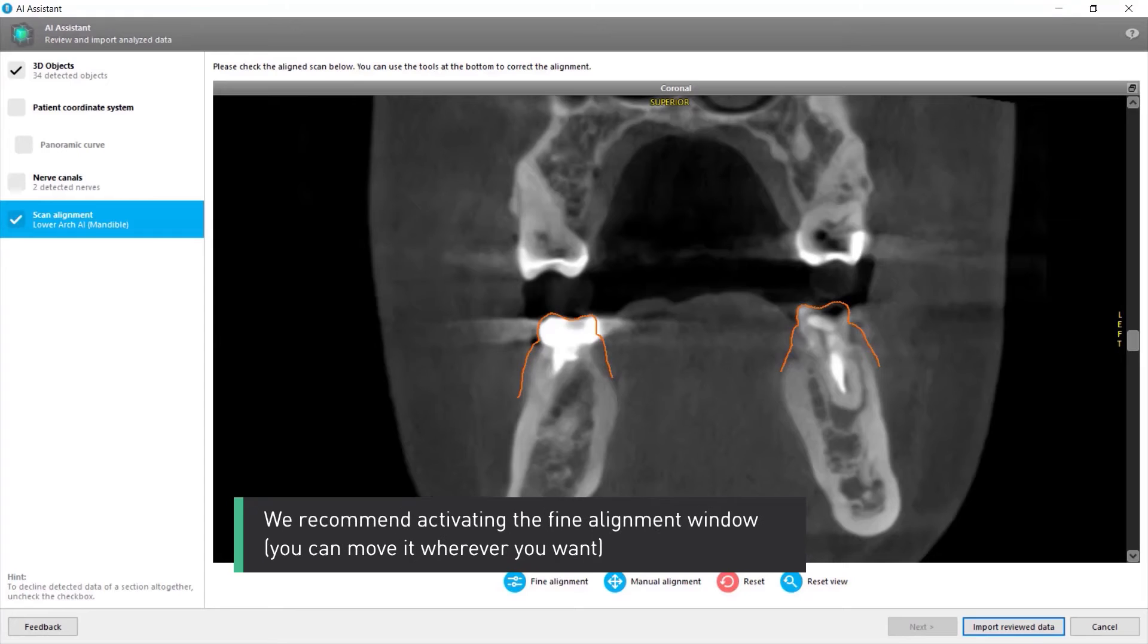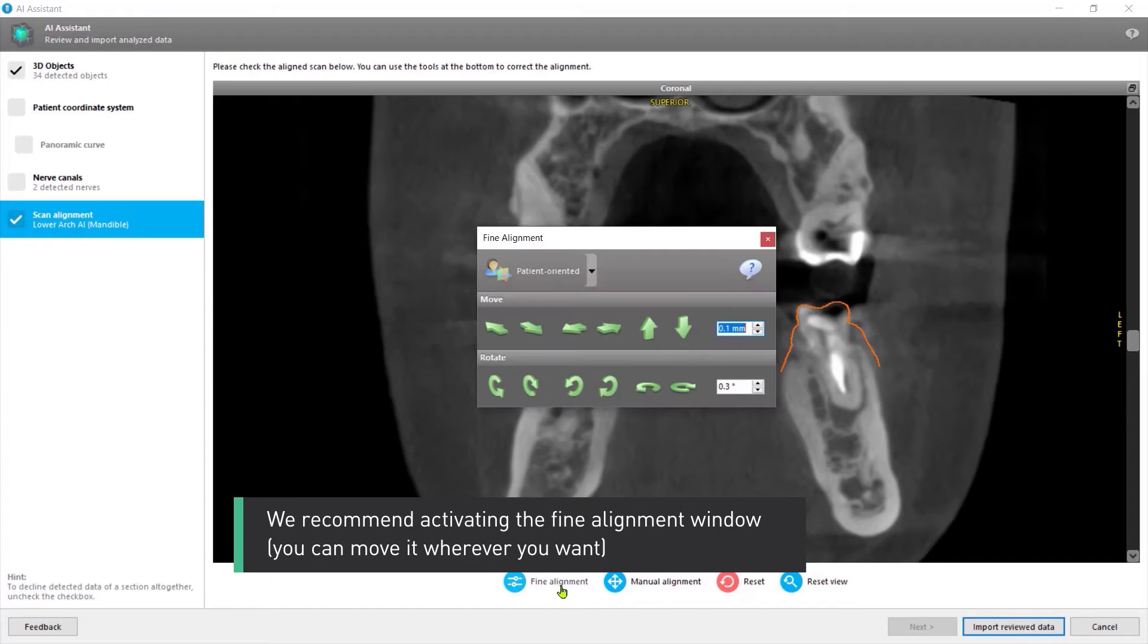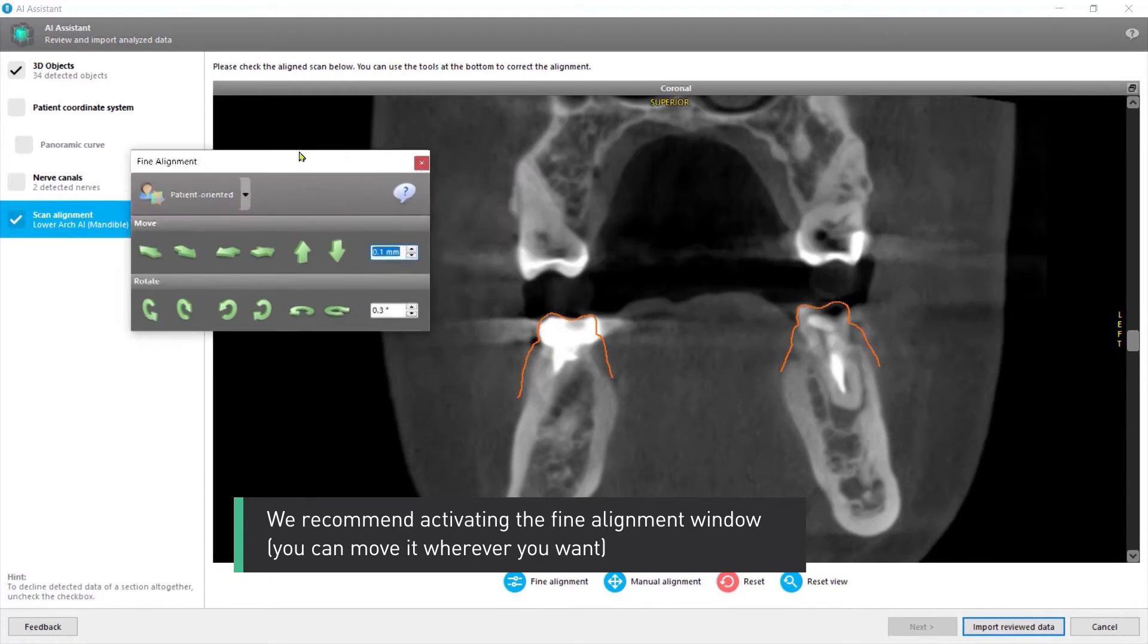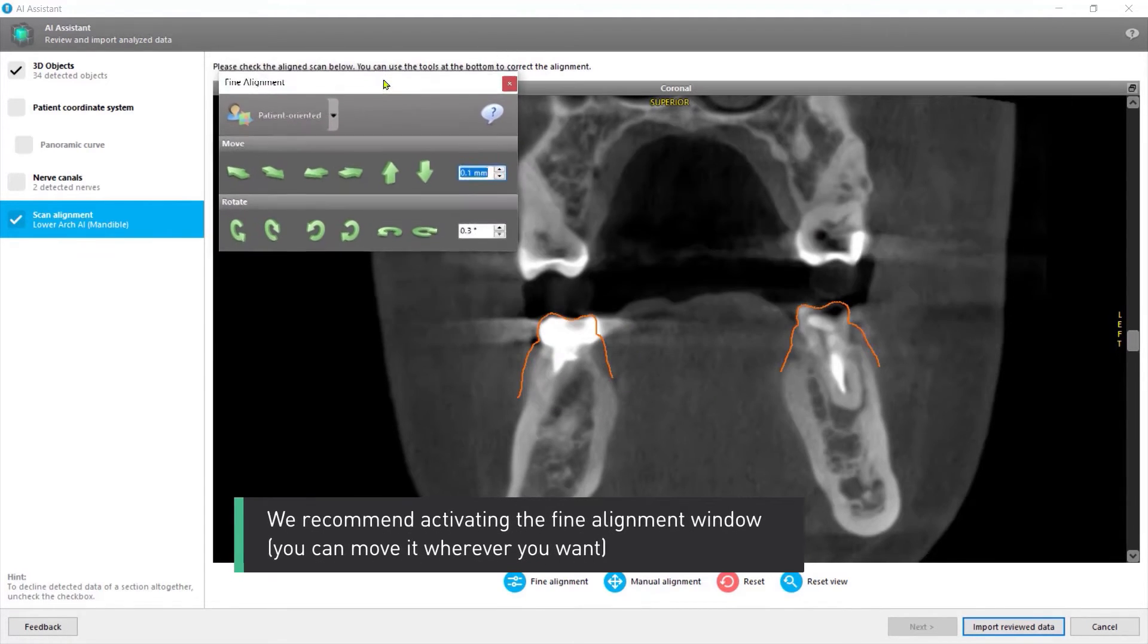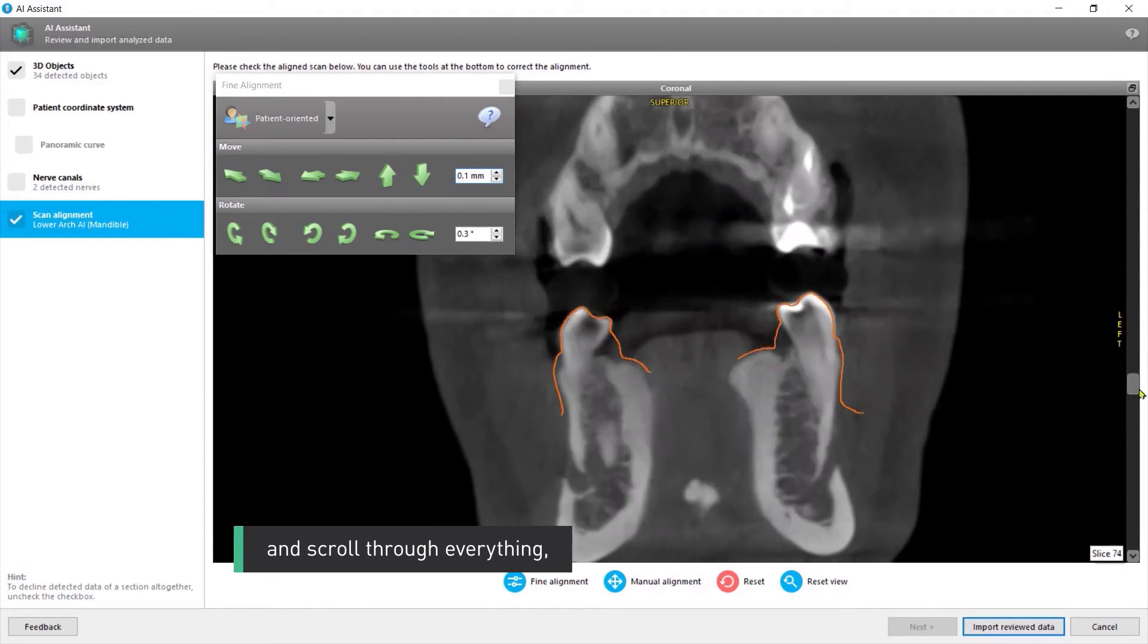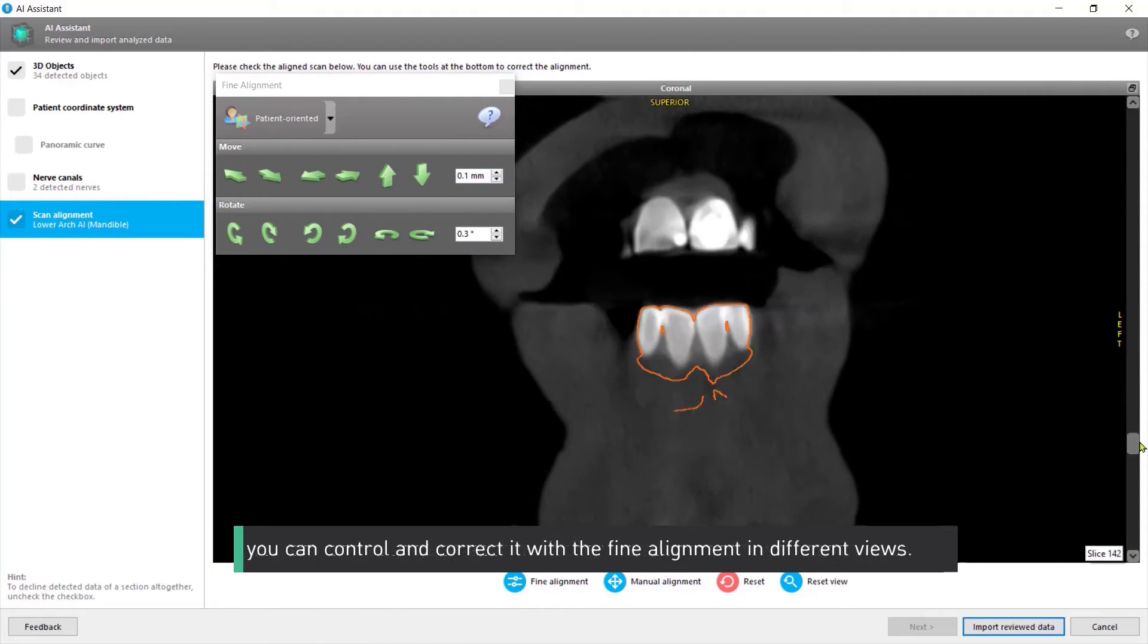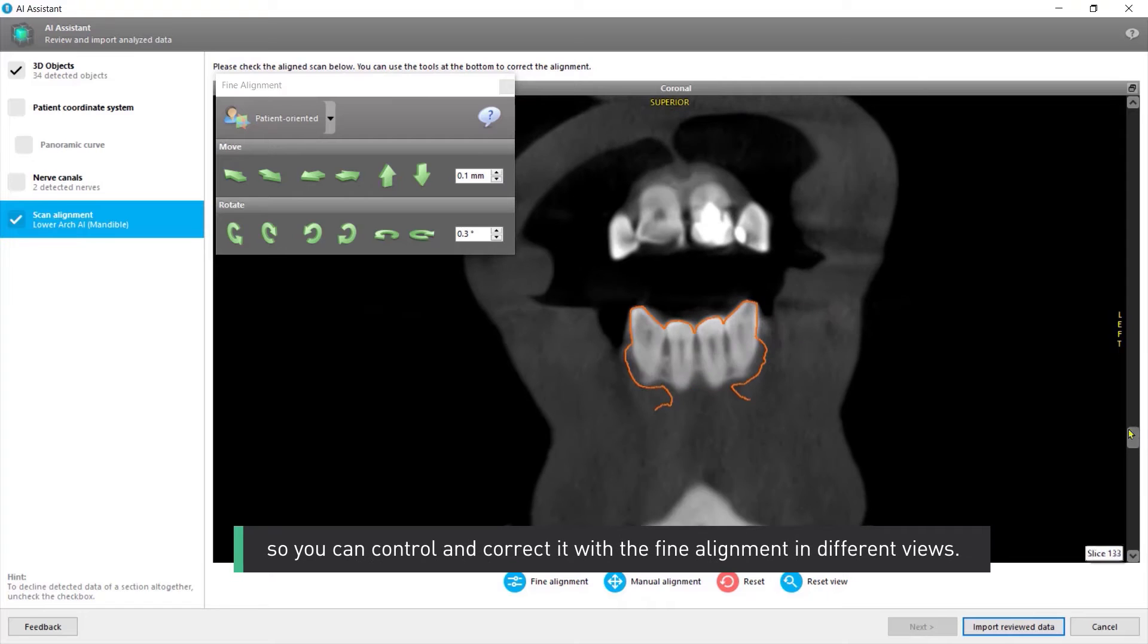We recommend activating the fine alignment window. You can move it wherever you want and scroll through everything. So you can control and correct it with the fine alignment in different views.